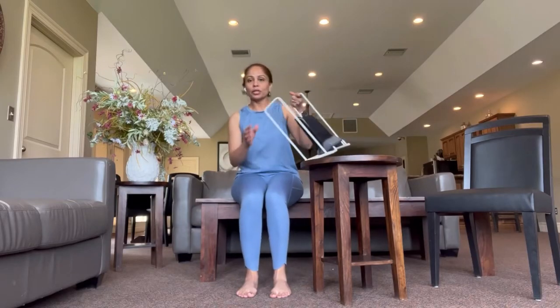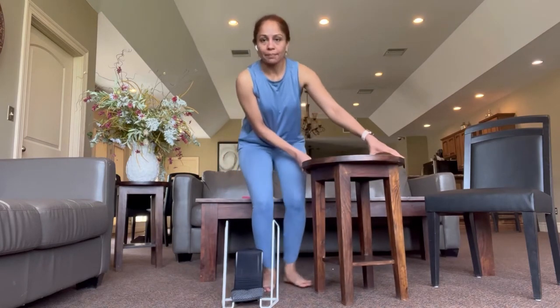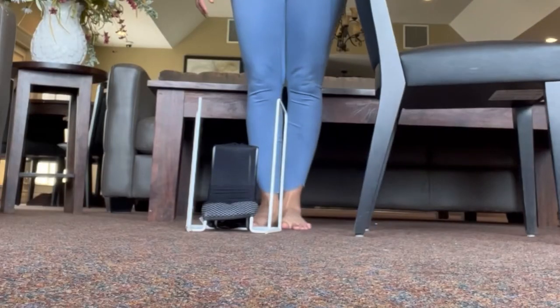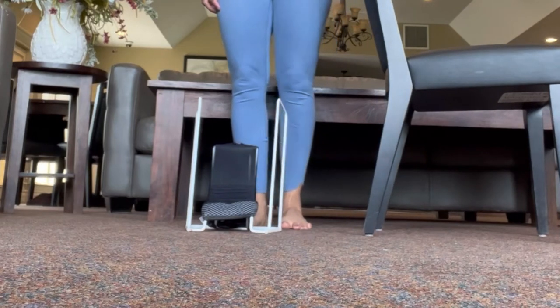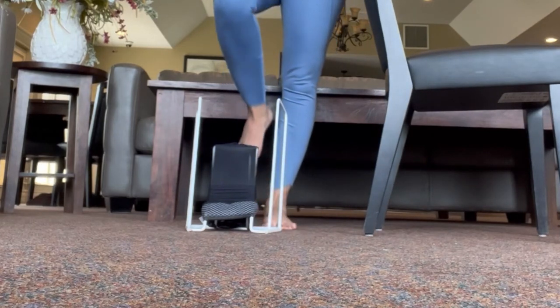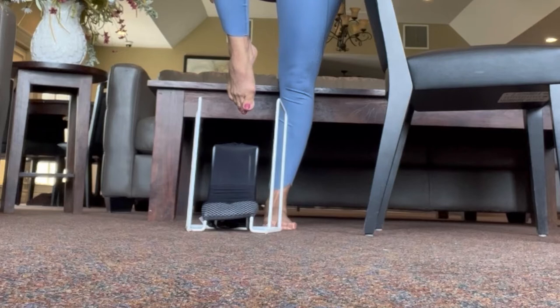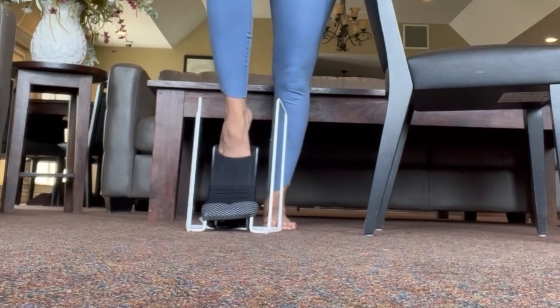Now you're ready — bring the Butler down to the floor. I recommend a chair nearby for balance just in case. Here is the tip I really want you to pay attention to: raise your knee as high as you can and point your toes down. If you need balance support, hold on and point your toes down like a ballerina.